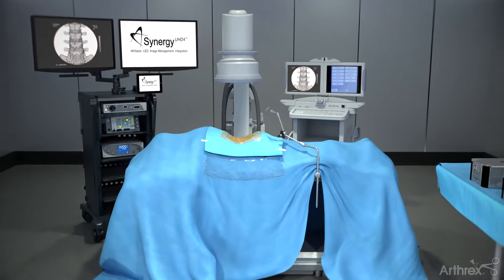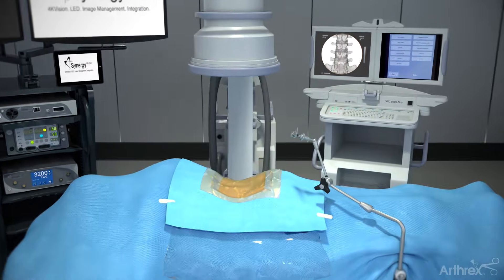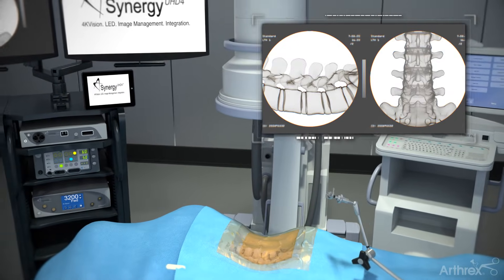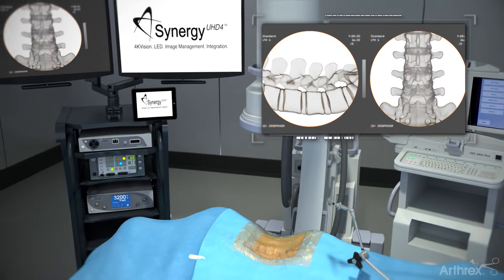Place the patient in the prone position and use a C-arm to verify the correct level being treated, using both AP and lateral images, based on the preoperative MRI.